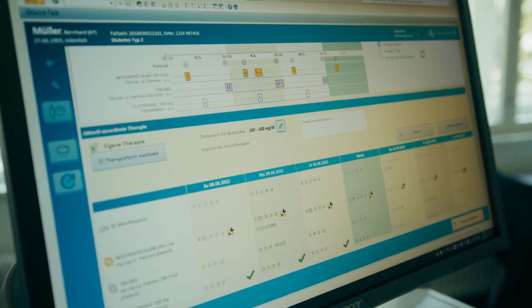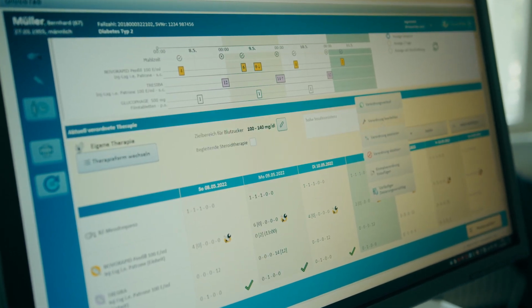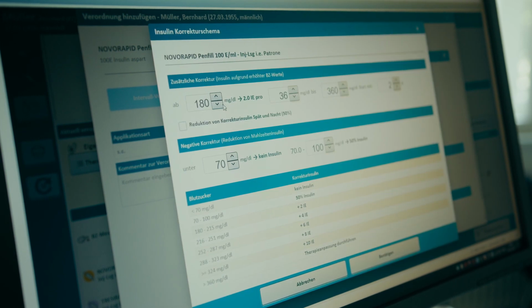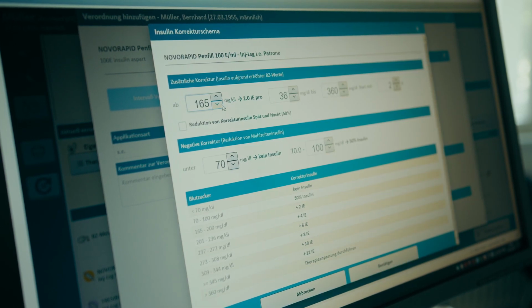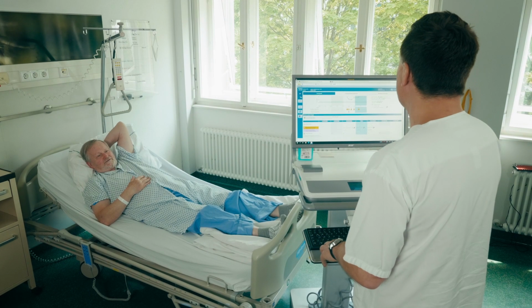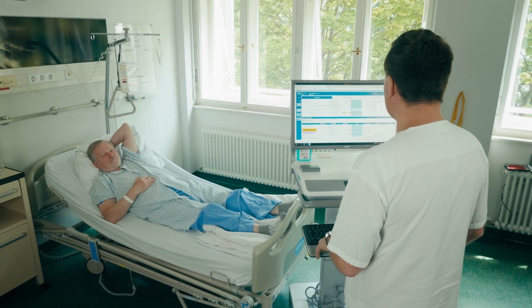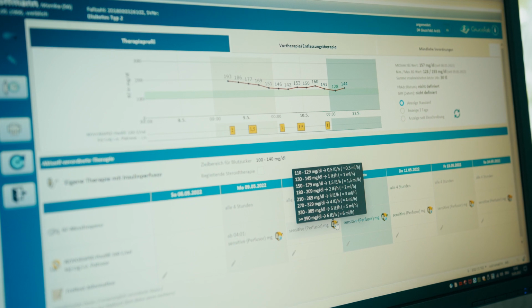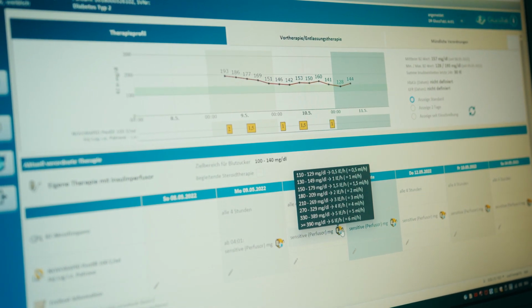There are specific functions such as ordering a supplemental insulin sliding scale or a bolus calculator for type 1 diabetes that can facilitate therapy. This enables diabetes-specific prescribing and individualized dose calculation. For an intravenous insulin infusion, the flow rate of insulin can be suggested based on a prescribed regimen, depending on the blood glucose level.